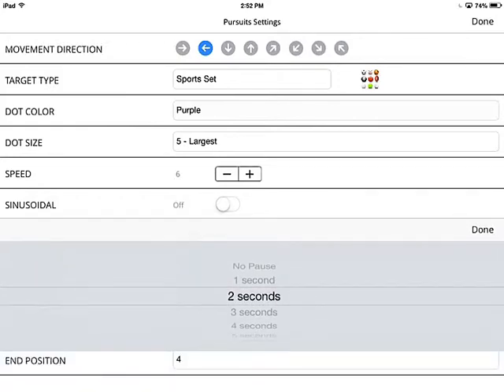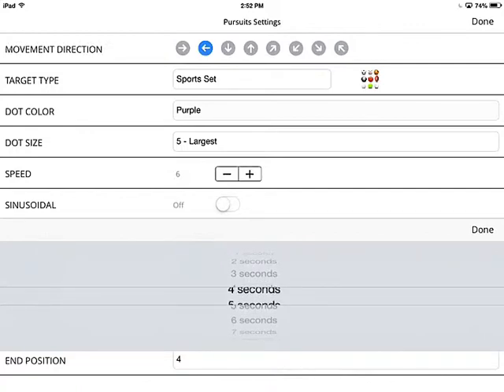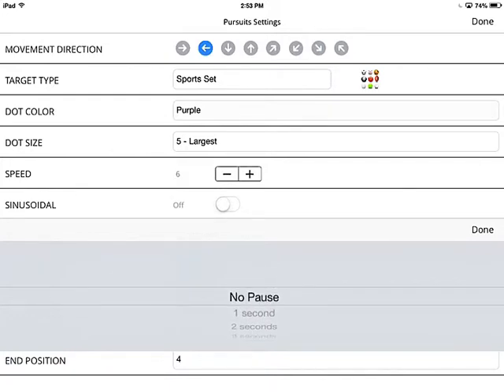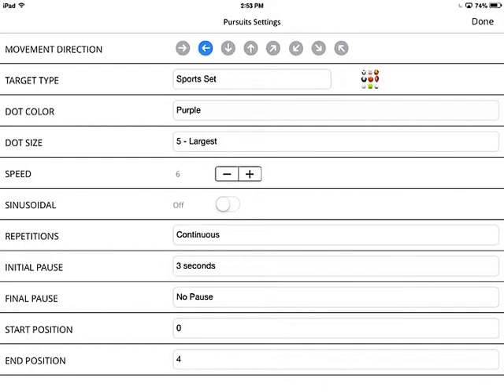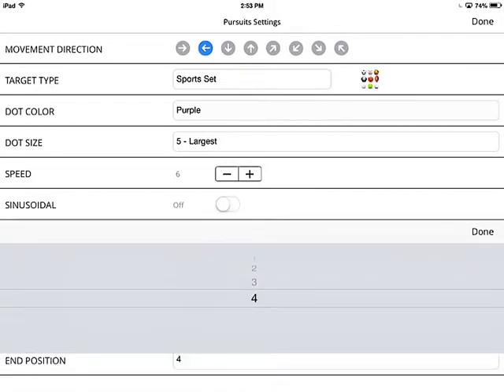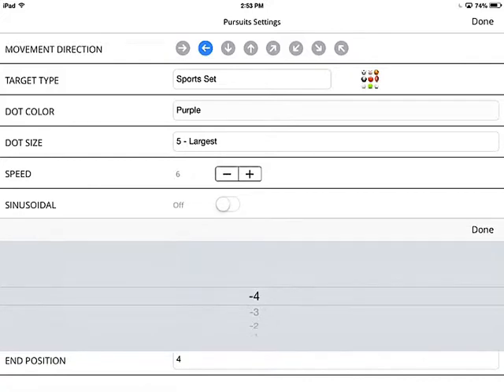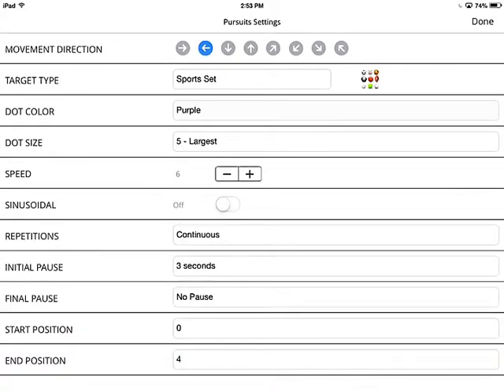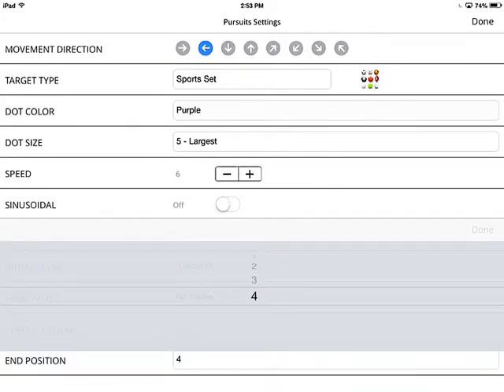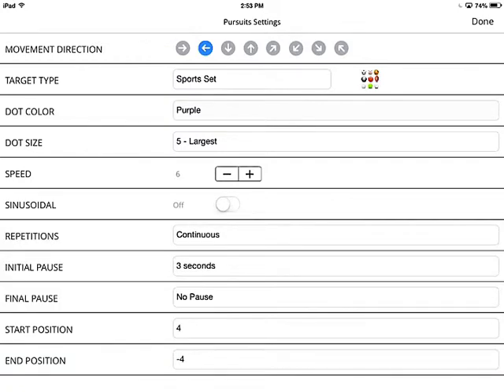The final pause controls how long the target remains at the end of the motion — let's set that to no pause. For start position, since I'm going right to left, I'll set start to 4 — all the way to the right — and end position to negative 4, which is the left edge. Positive numbers are on the right side and negative numbers are on the left. So start position is 4 and end position is negative 4. Let's hit start.